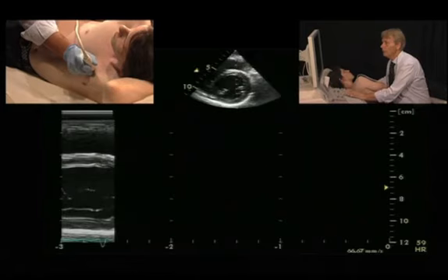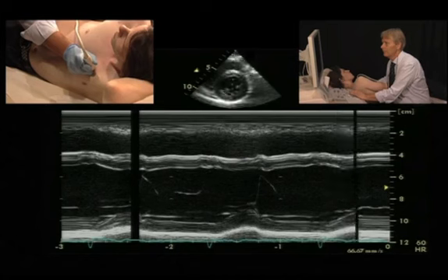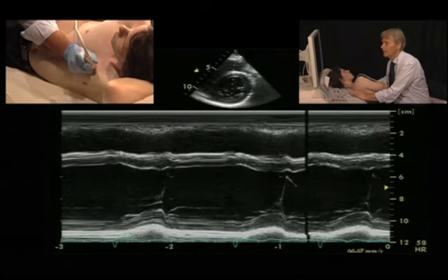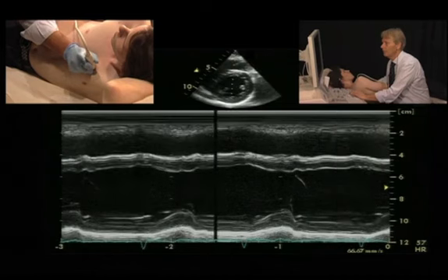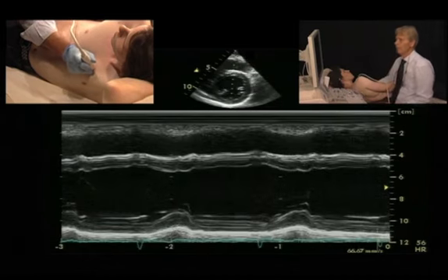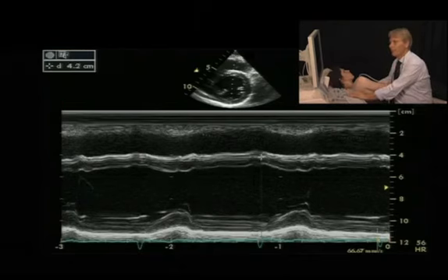you will put the M-mode exactly through the middle of the left ventricle and optimize the image so that you have a very good contour, and then freeze the image and perform the measurement of the septum at diastole. So we have the biggest width of the left ventricle shortly before the QRS complex starts. So this is where you would start with your M-mode measurement of the septum.